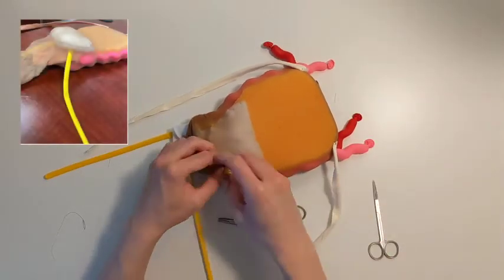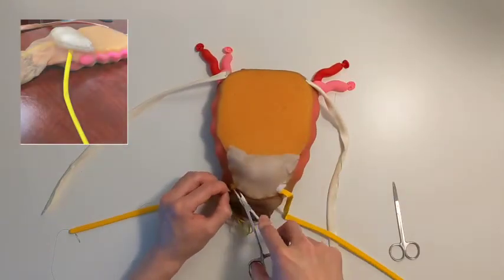Roll the knee highs completely down. Cut an opening in the knee highs to allow the ureters to exit.